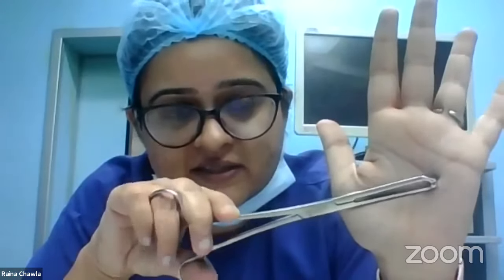Primarily, we use it to hold the rectus sheath, the peritoneum, and the angles of the uterus in a cesarean section. It has slightly traumatic serrations at the end, a small triangular surface area, and again you have long Allis forceps and short Allis forceps. It is also used to hold the vaginal vault post hysterectomy, once the uterus is out, to hold the edges of the vault. The postgraduates who are listening, this is the instrument used.